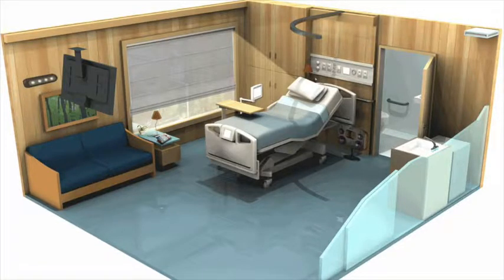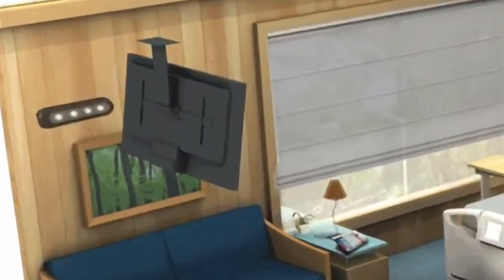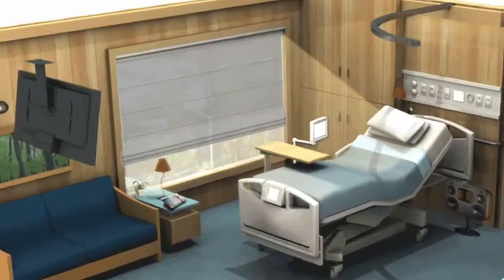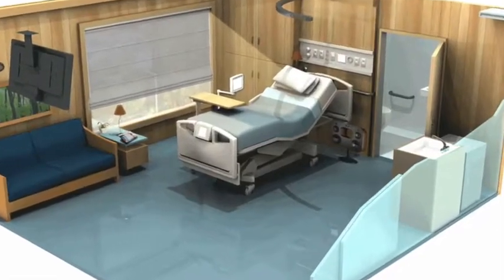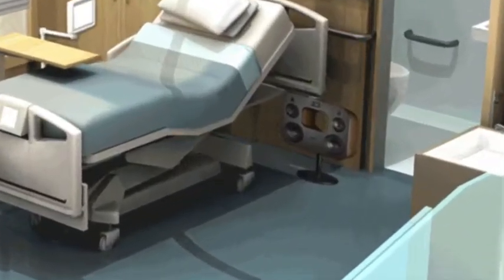Within the room, patients can control the light in the room by staring at the green LED in the corner. Additionally, opening and closing of the blind can be controlled by holding one's eyes closed for a few seconds. Blinking several times in a given time frame will turn on or off the music. We set a speaker beside the bed to play some relaxing music.